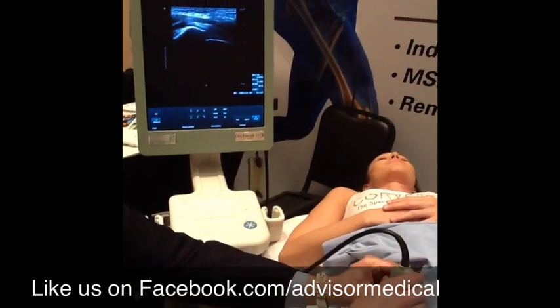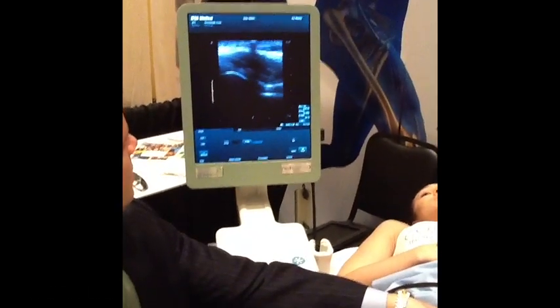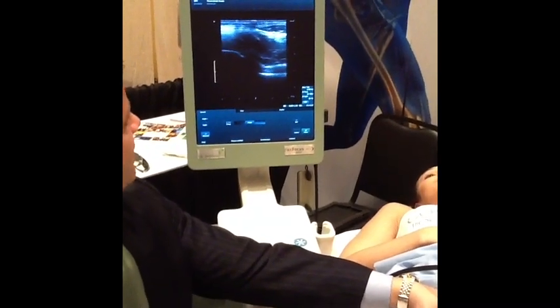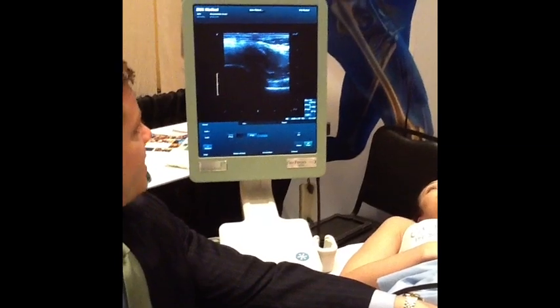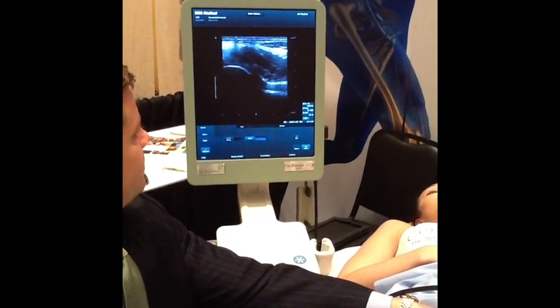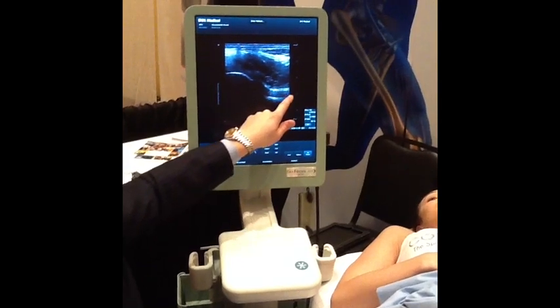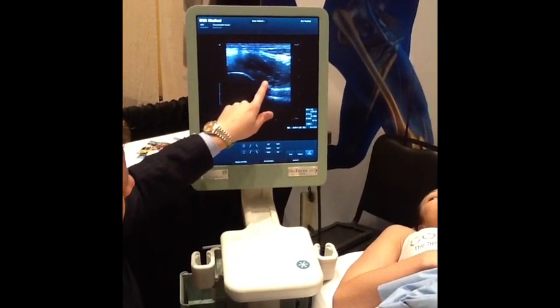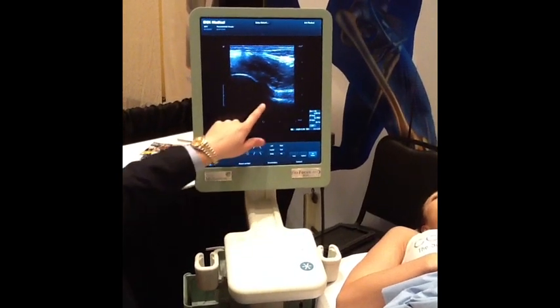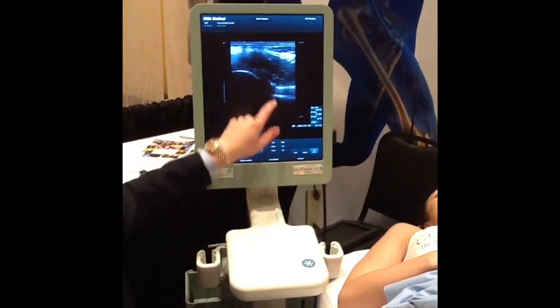Let me go back and find it. Our target right here — I see the head and I see the neck. Here's the head of the femur going into the neck. I see the ligament coming down here and the space between the bone and the ligament — this is your capsule. That is your target area.